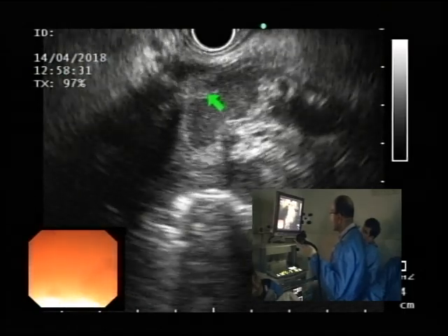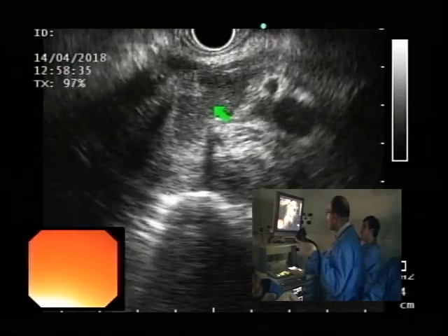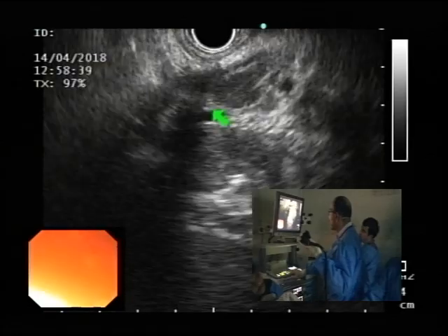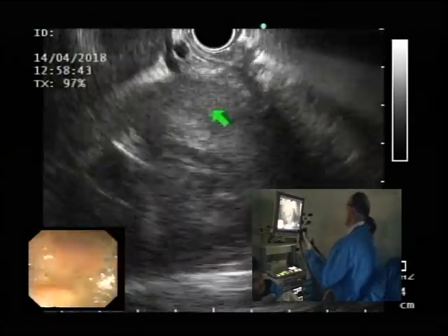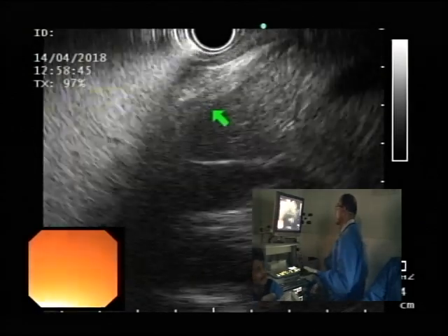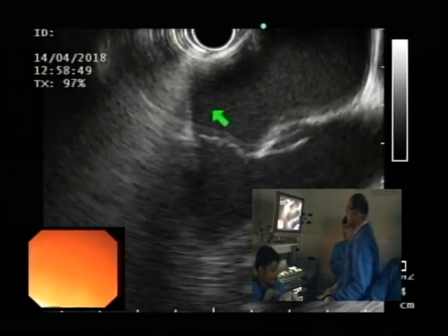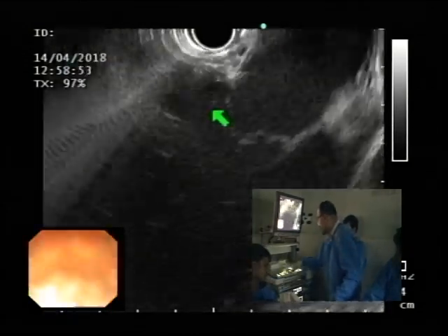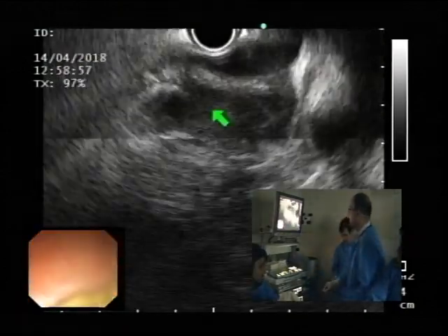But it's possible. This was what I convinced myself of, that maybe it was the duct, but it could be a cyst within the gland itself. So I think we can move on to the next case. Absolutely. They need to take another look at the MRCP and go from there. Sure. And you already went through the mediastinum, right? Yeah, I did go through the mediastinum. Okay, so we can move on to the next case. Sure.